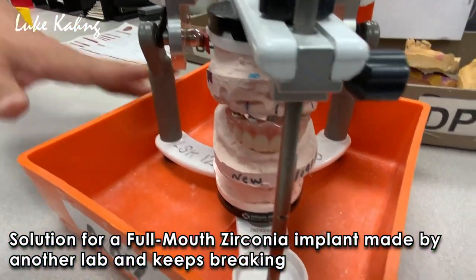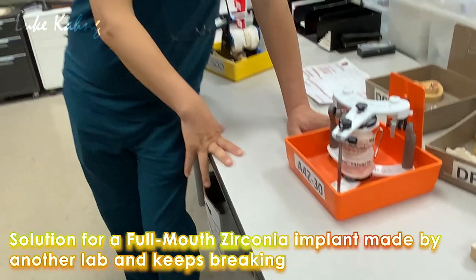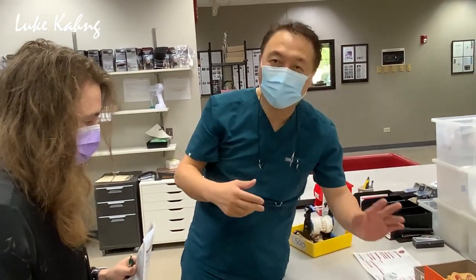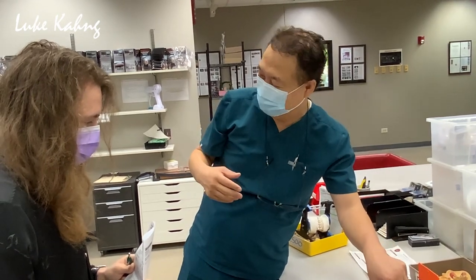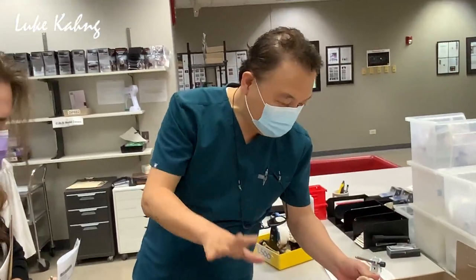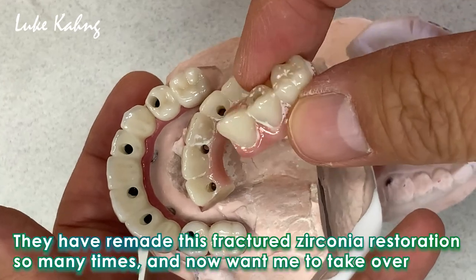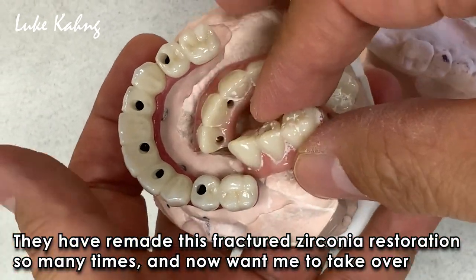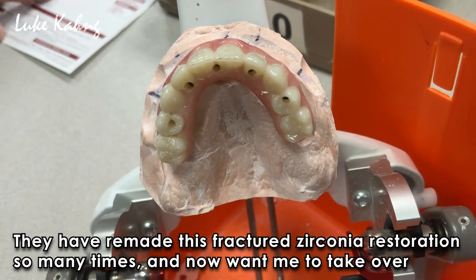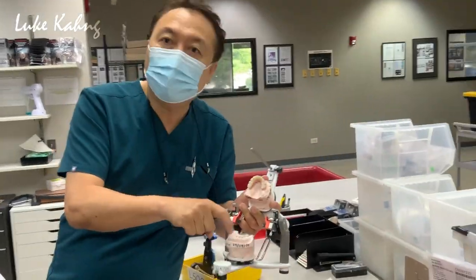So the doctor said they send me cases probably twice a year, when they have problem cases. So, one, two, three, four, five implants. And he said, attention, look: fractured zirconia bridge. They made a fractured zirconia so many times. Okay, so now they want me to take over. I have to evaluate the cases.